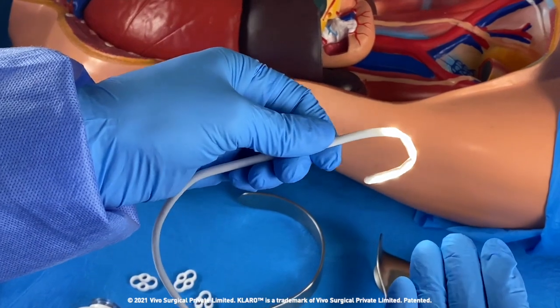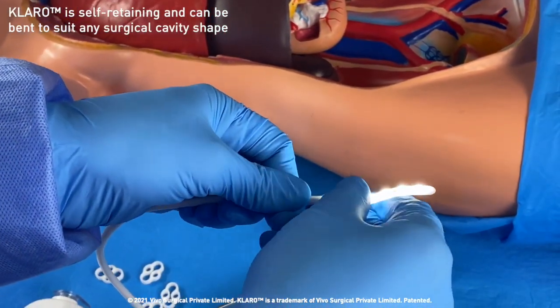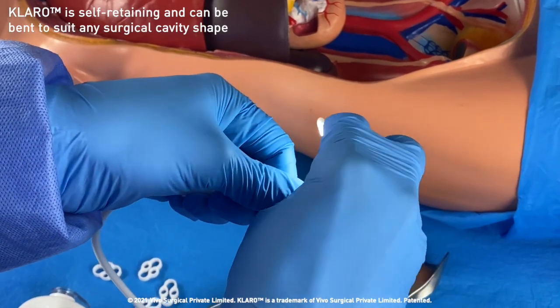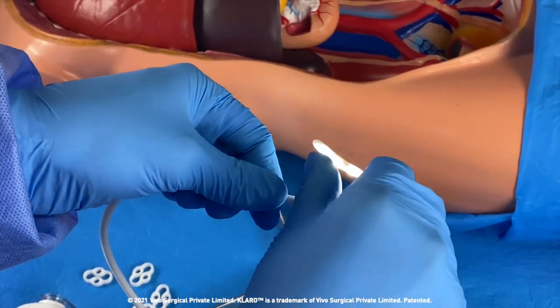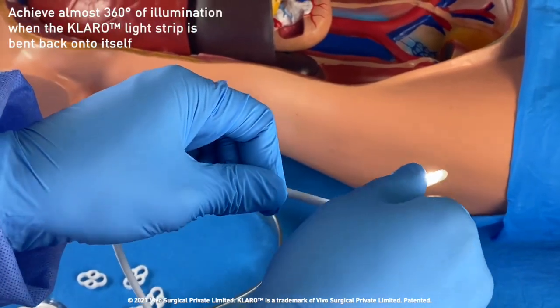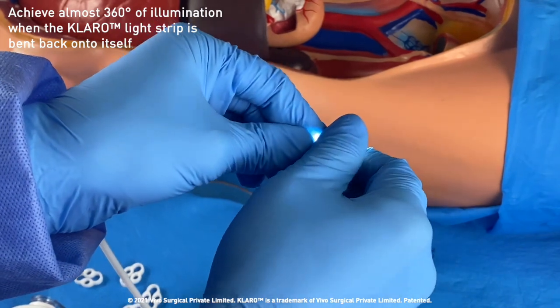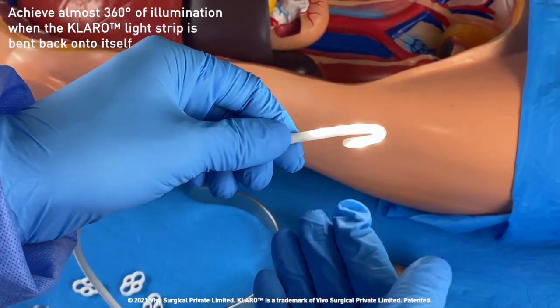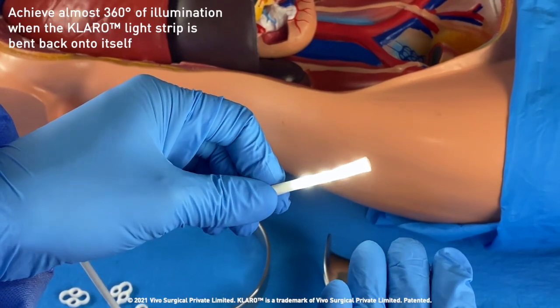This overall lighting solution is self-retaining and can be bent into any manner to suit open cavities of various shapes and sizes. Claro can achieve the widest surgical illumination angle possible by bending the light strip back onto itself as shown. This greatly reduces frequent light repositioning and surgical disruptions.